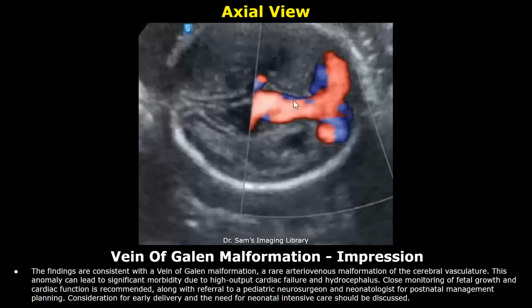along with referral to a pediatric neurosurgeon and neonatologist for postnatal management planning. Consideration for early delivery and the need for neonatal intensive care should be discussed.